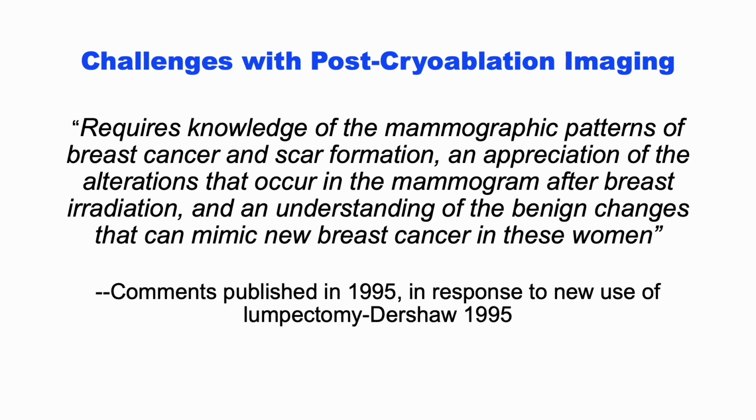interpretation of mammograms after lumpectomy requires knowledge of the mammographic pattern of breast cancer and scar formation, an appreciation of the alterations that occur in the mammograms after breast radiation, and an understanding of the benign changes that can mimic new cancers in women. This journal article was published in 1995. The very same remarks can be applied to cryoablation today.